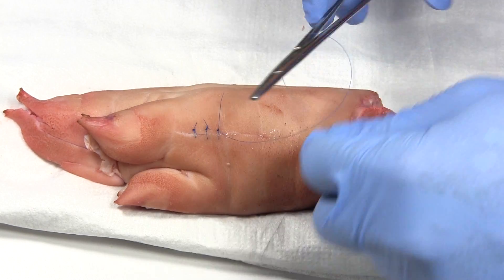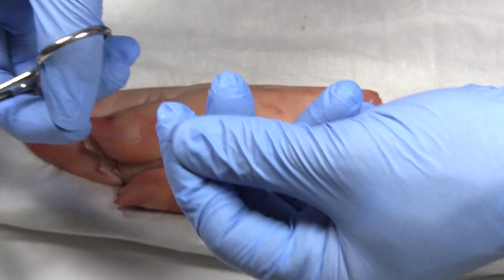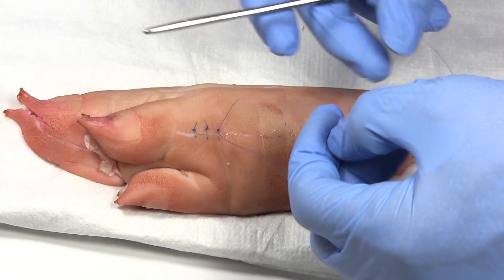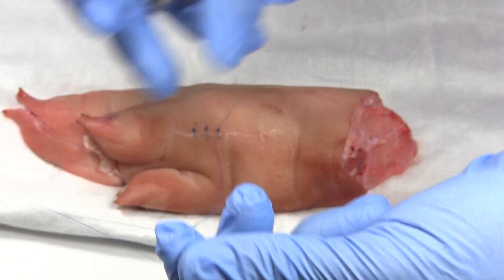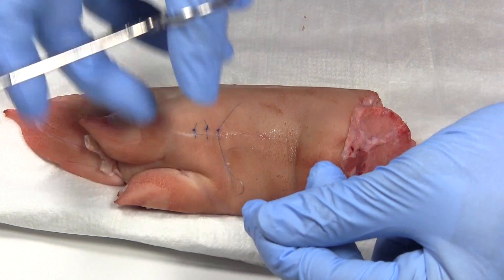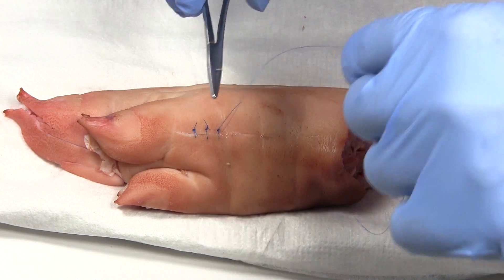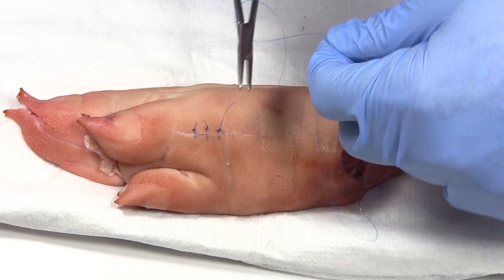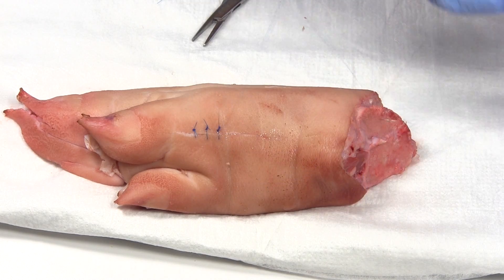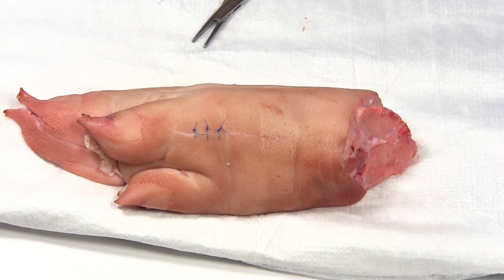Here's another tip: when you have all this extra thread, try to hold it down close — it makes it a lot easier to work with. If you're holding it way out with lots of slack when you're trying to do the wrapping, it becomes too hard to work with. Hold it close and it's much easier. Once you get into it, you get a little rhythm going and can actually do it fairly quickly. Very simple — hence the name, simple interrupted sutures.